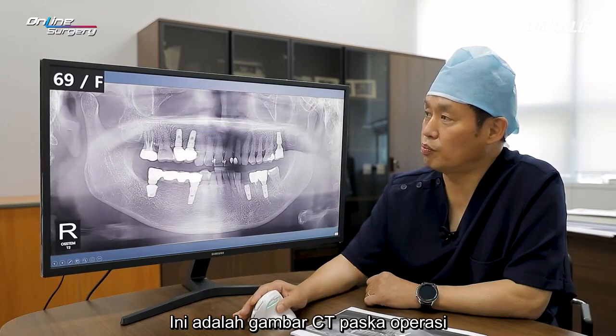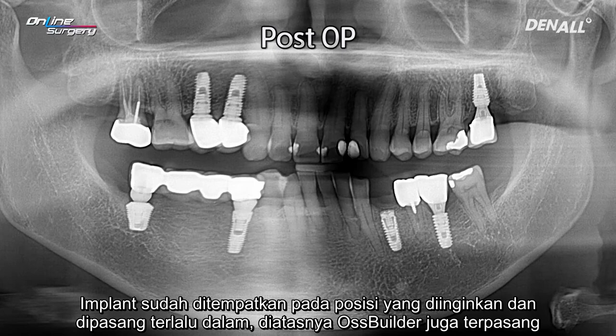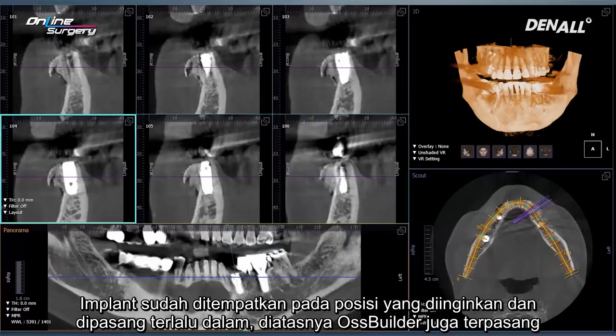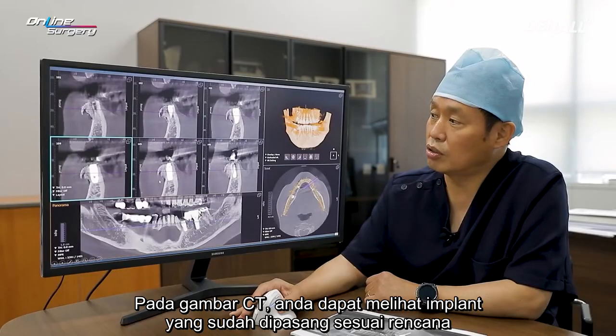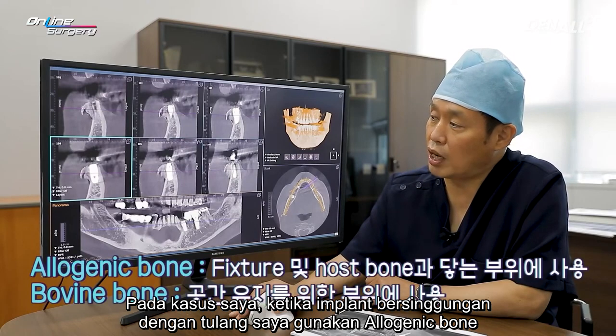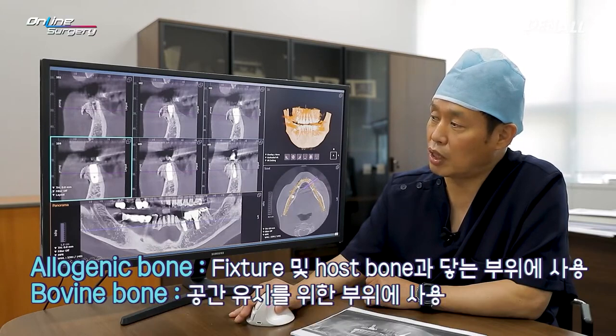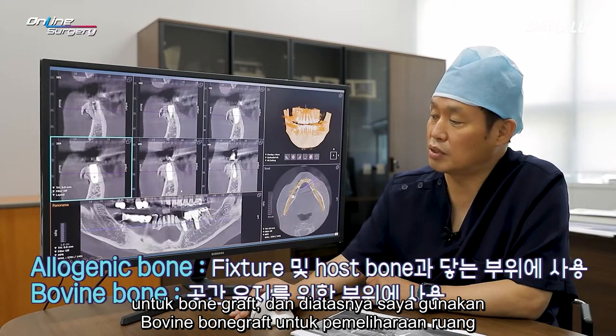This is the post-op image. The implant has been placed in the desired position. It has been placed deep. On top of it, OssBuilder has been placed. On CT, you can see that the implant has been placed in the planned position. In my case, where the implant is in contact with host bone, I use allogenic bone for bone graft, and on top of it, I use bovine bone graft for space maintenance.